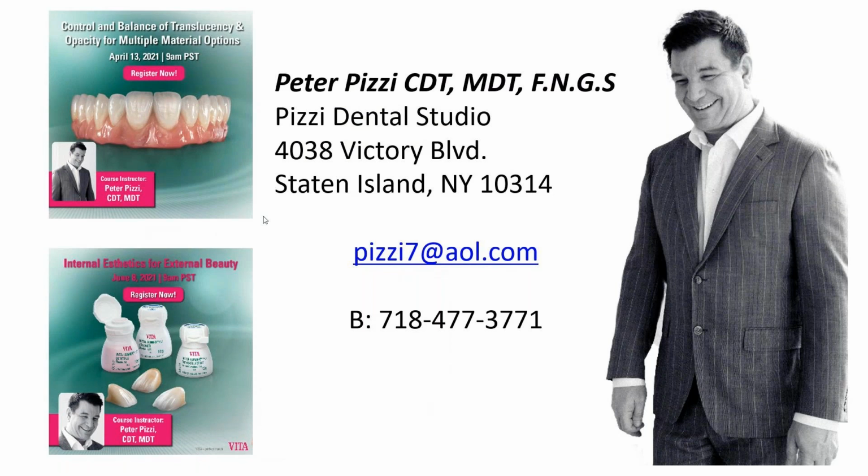The doctor's job now has become, and putting more onus back on the clinical side, is we want them to mask that, and they could use something like Speed CEM or Panavia or whatever they would like. I prefer they mask it with a similar color, meaning that if the prep shade on the 9 was A2, then use an A2 opaque cement to mask that prep. It's a curable material, and then when they impression, what we're getting is the two ideal colored preps.